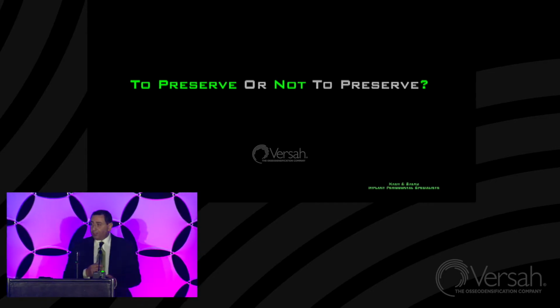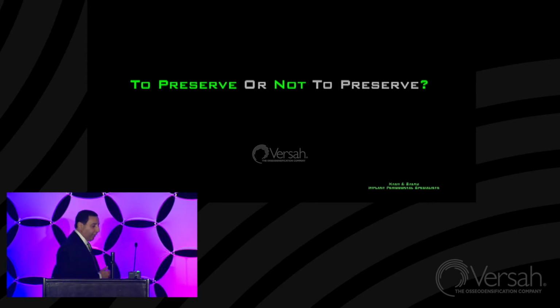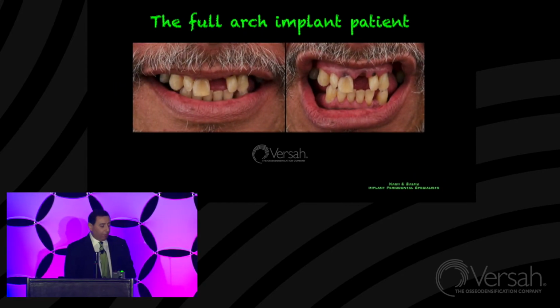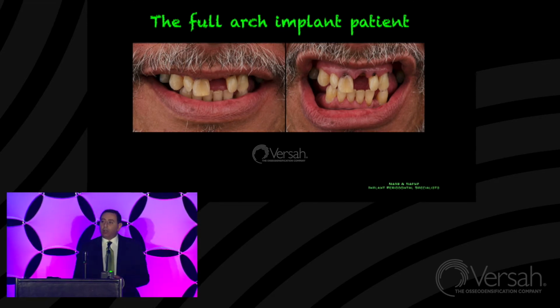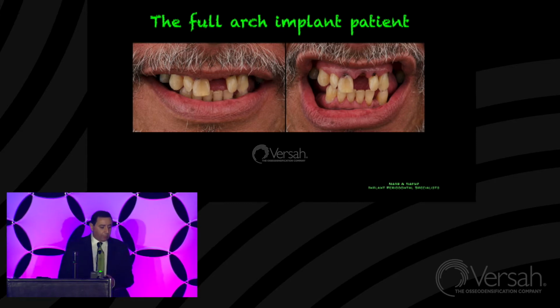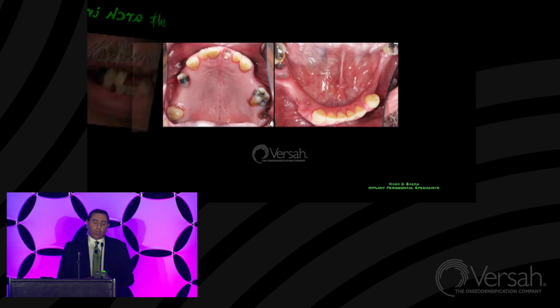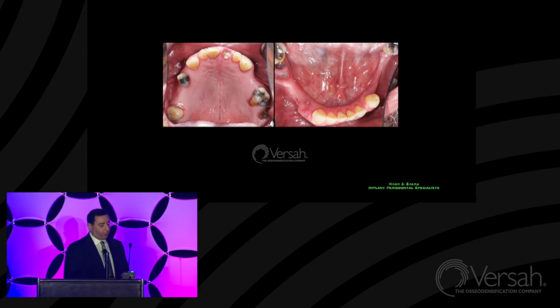So let's look at a few cases, and based on those cases, I'm going to tell you my experience with the Osseodensification system. This patient was referred to me by a prosthodontist, Dr. Jonathan Esquivel from LSU School of Dentistry, faculty practice. The patient had some problems, mainly a lot of decay and non-restorable dentition, and an arch that was not amenable to long-term results. This is the maxilla and the mandible, as you can see them. Some teeth have decay, some teeth are not good support for full arch fixed restorations, and he has quite a severely resorbed ridge.